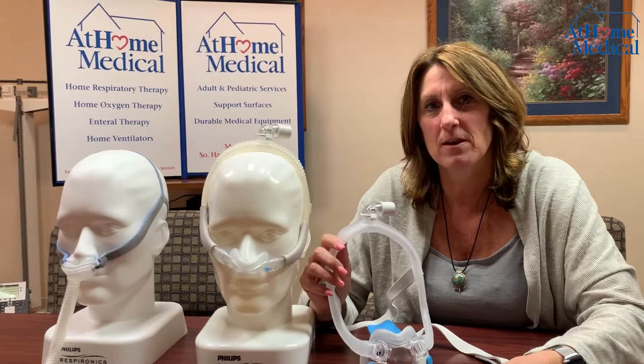Hi, and thank you for choosing At Home Medical. My name is Kim. I'm a respiratory therapist. I'm going to go over some masks — what different types there are, how to clean the masks, how to place them on your face, and how to make them adjustable.